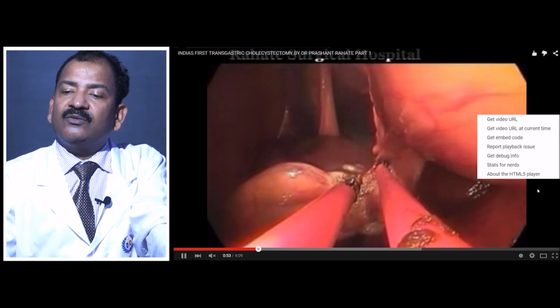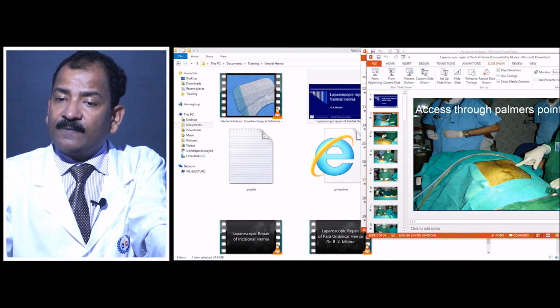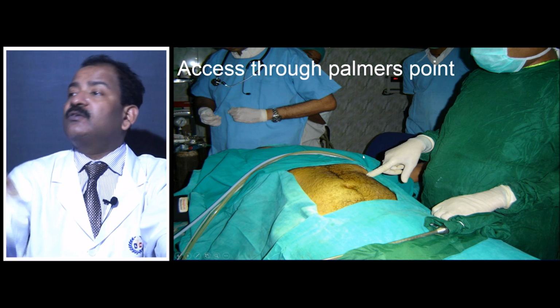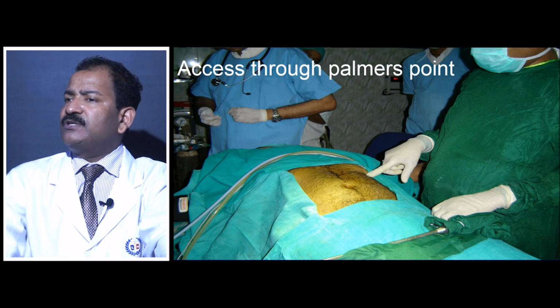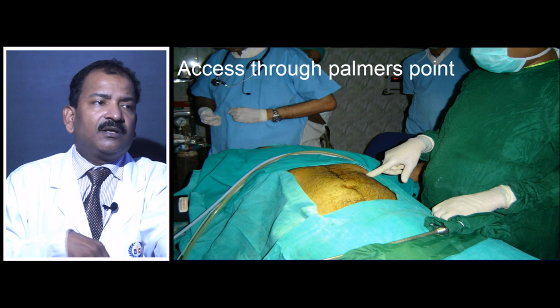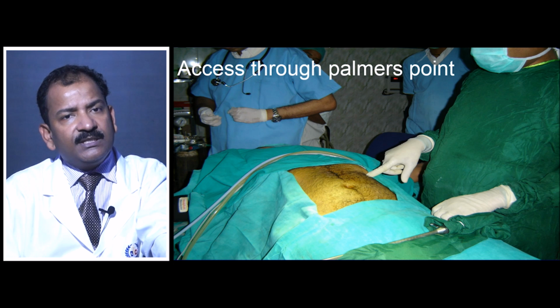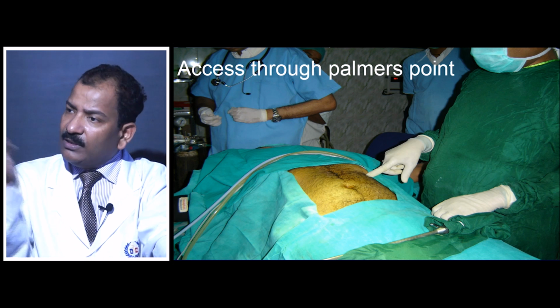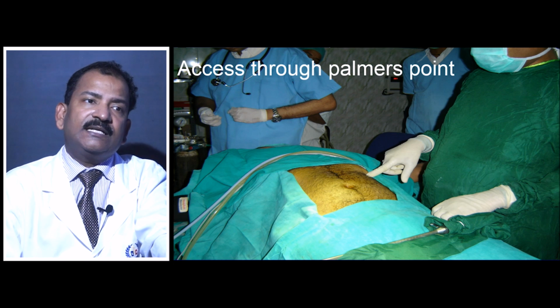That is why I am telling you that the stomach is a good organ to perforate. Even if it is perforated accidentally by your Veress and trocar, you do not have to worry, just put a nasogastric tube and keep on intermittent aspiration. It will heal spontaneously, because the stomach has an oblique layer of muscle which has a great capacity of healing on its own.